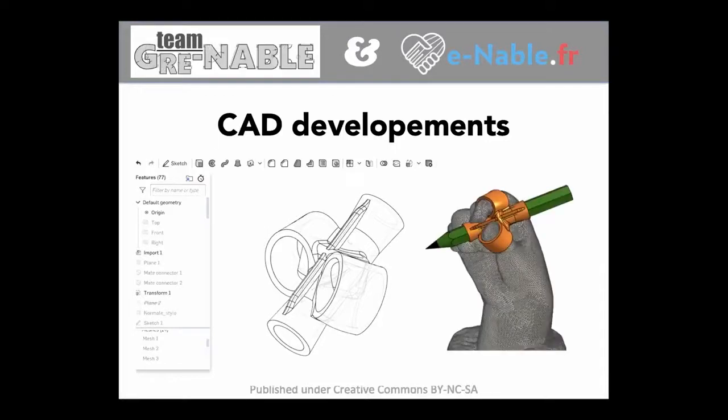From the first drawing to the final test, we can see that our design was fitting the needs when we put the result on the STL file. So we see that it's really done. We are designing in context. That means that we are always looking at what we are designing compared to the receiving end and so on. It's not a miracle. It's just the result of a good design.